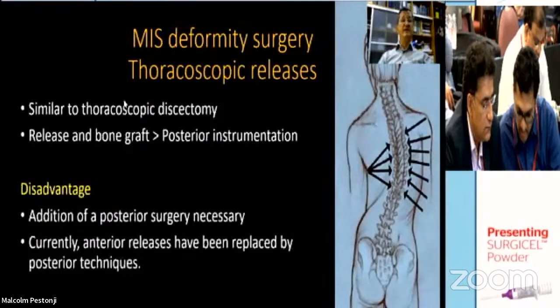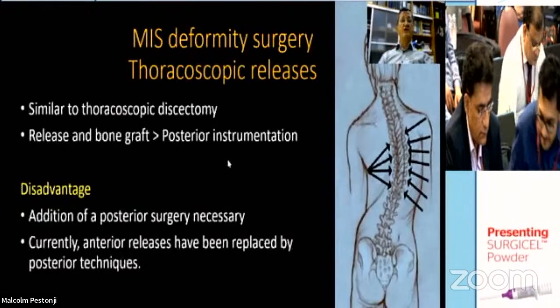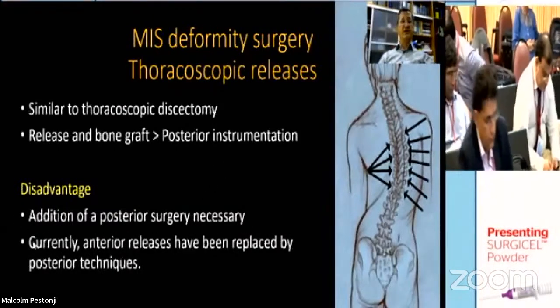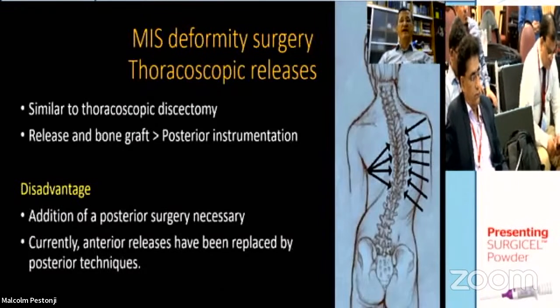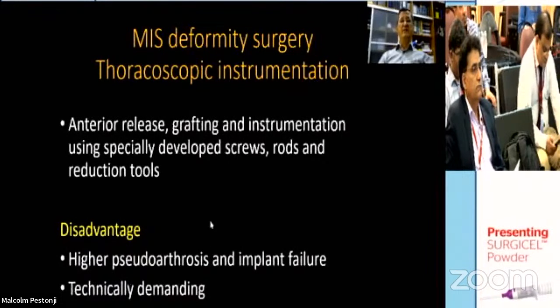Thoracoscopic releases, similar to thoracoscopic discectomy, releasing and bone grafting. Disadvantage, addition of a posterior surgery is still necessary. Currently, anterior releases have been replaced by posterior techniques, so there is not much need of doing that with a thoracoscopic technique. What about thoracoscopic instrumentation? It is possible, but disadvantages of higher pseudoarthrosis and implant failure, technically demanding, and mostly abandoned.